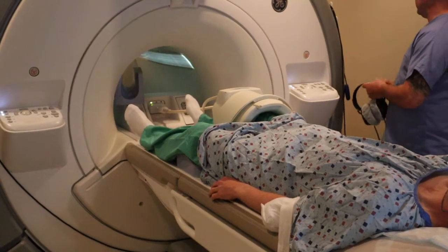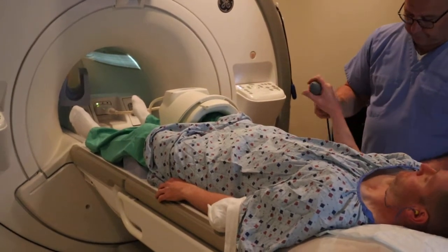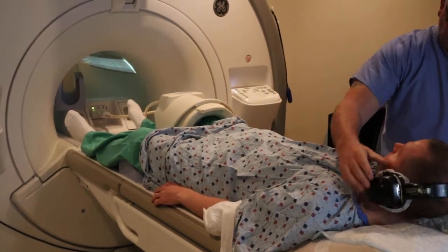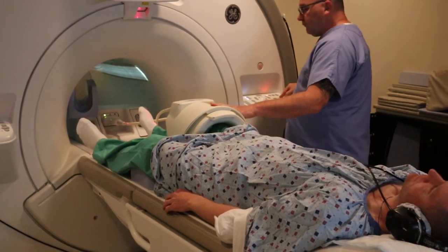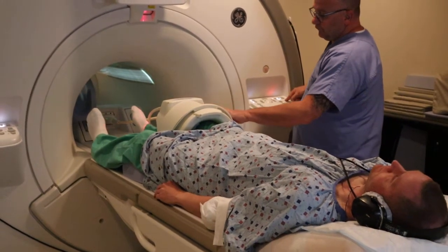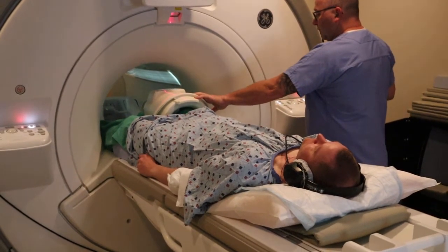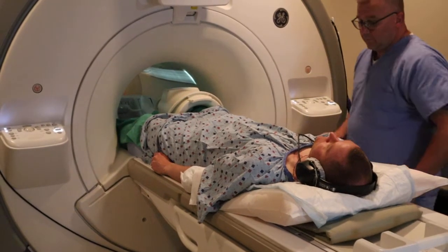You want to make sure that the foot remains in an anatomical position. Give the patient an emergency ball to get the tech's attention, and a headset to listen to music. You're going to do the landmark on the coil, which is the apex of the patella, and advance the scan.